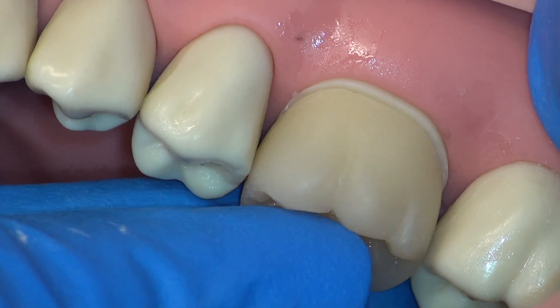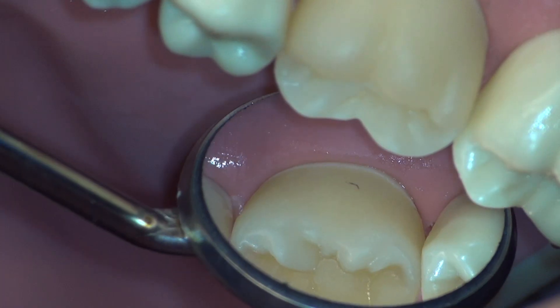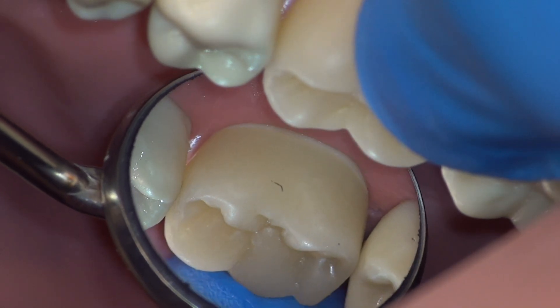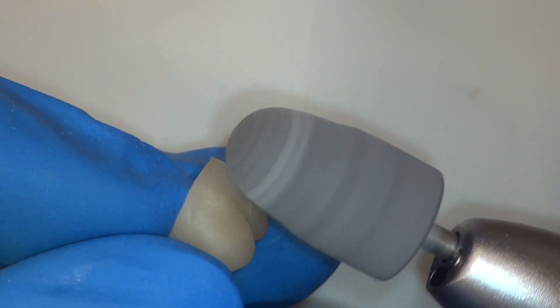We'll try the temporary on and evaluate the fit. Evaluate the entire margins circumferentially and do your best to evaluate the interproximal areas visually as well. Gentle rocking with a hemostat and a cotton roll is always a good way to remove the temporary safely.